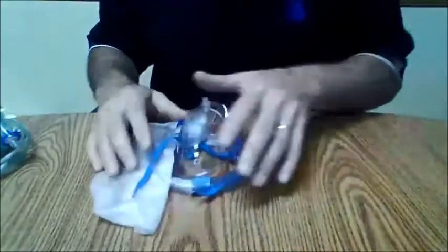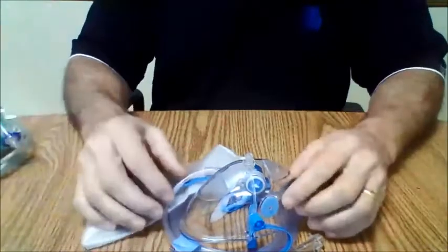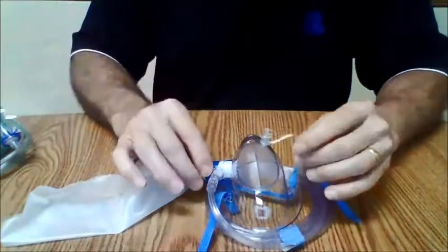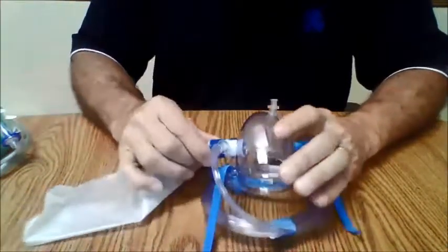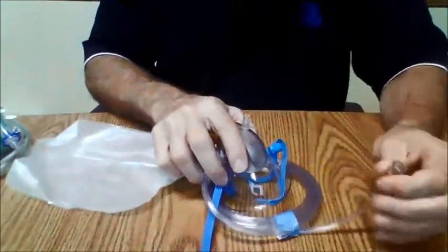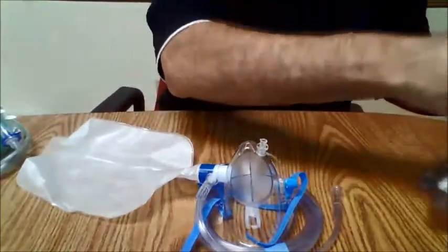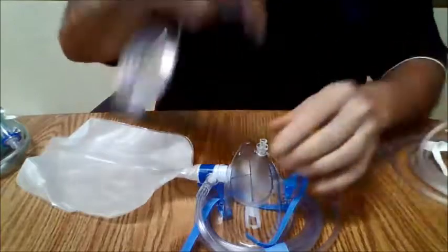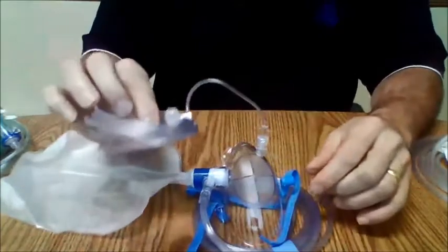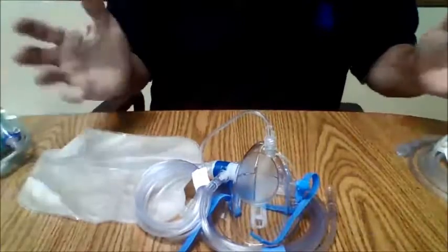The last mask we're going to talk about today is our POM mask, or procedural oxygen mask. This comes in a couple different flavors. We have it here in what we call the Elite, and it's pre-attached with an oxygen reservoir bag. I would connect my oxygen tubing here, and I would connect my CO2 tubing over here. A lot of times, once again, they have the CO2 tubing hanging from the machine. You would connect this to your CO2 monitor. And this is only used for upper GI procedures.